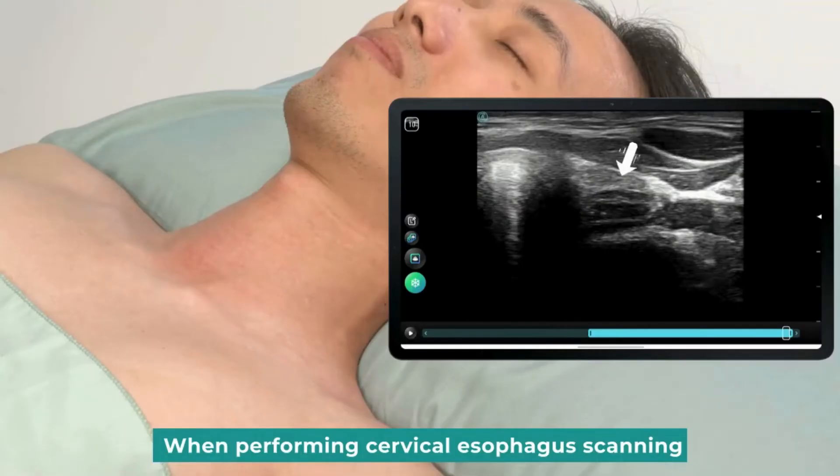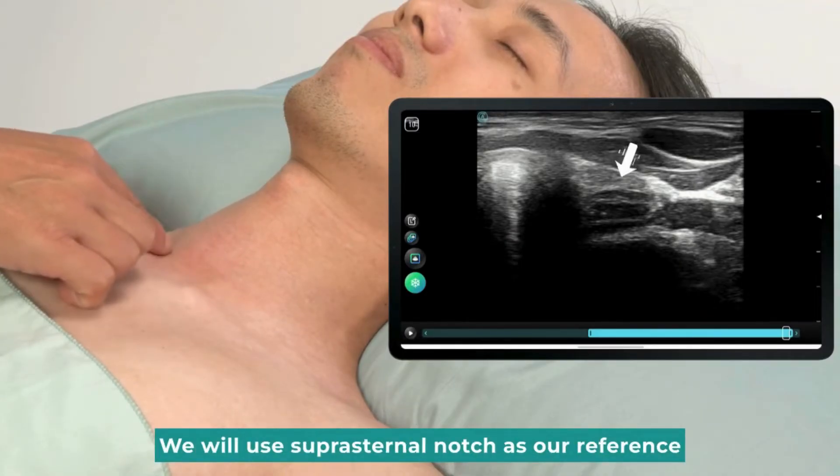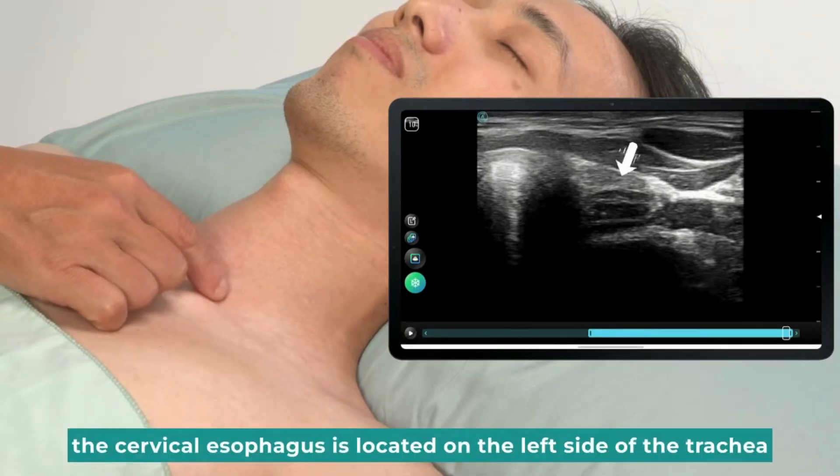When performing cervical esophagus scanning, we will use the suprasternal notch as our reference. The trachea will be our main landmark in this session. The cervical esophagus is located on the left side of the trachea.